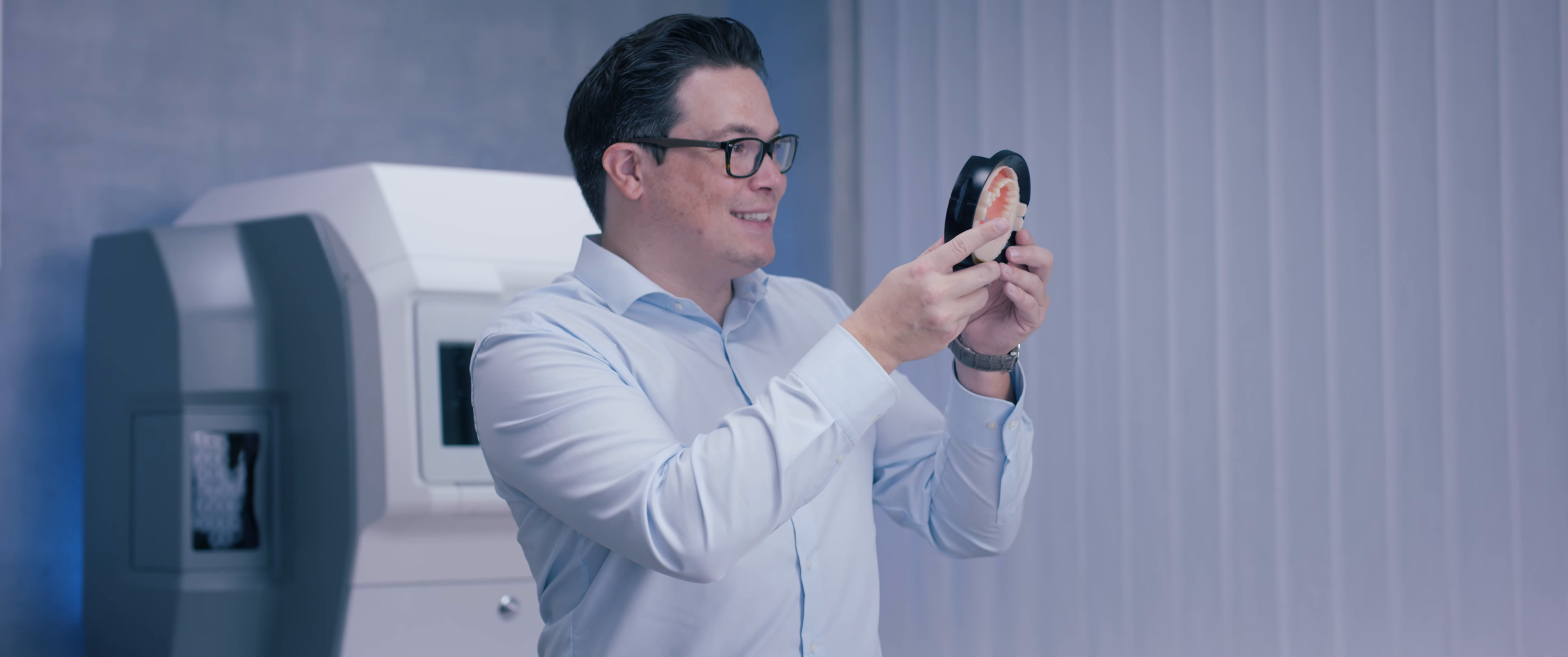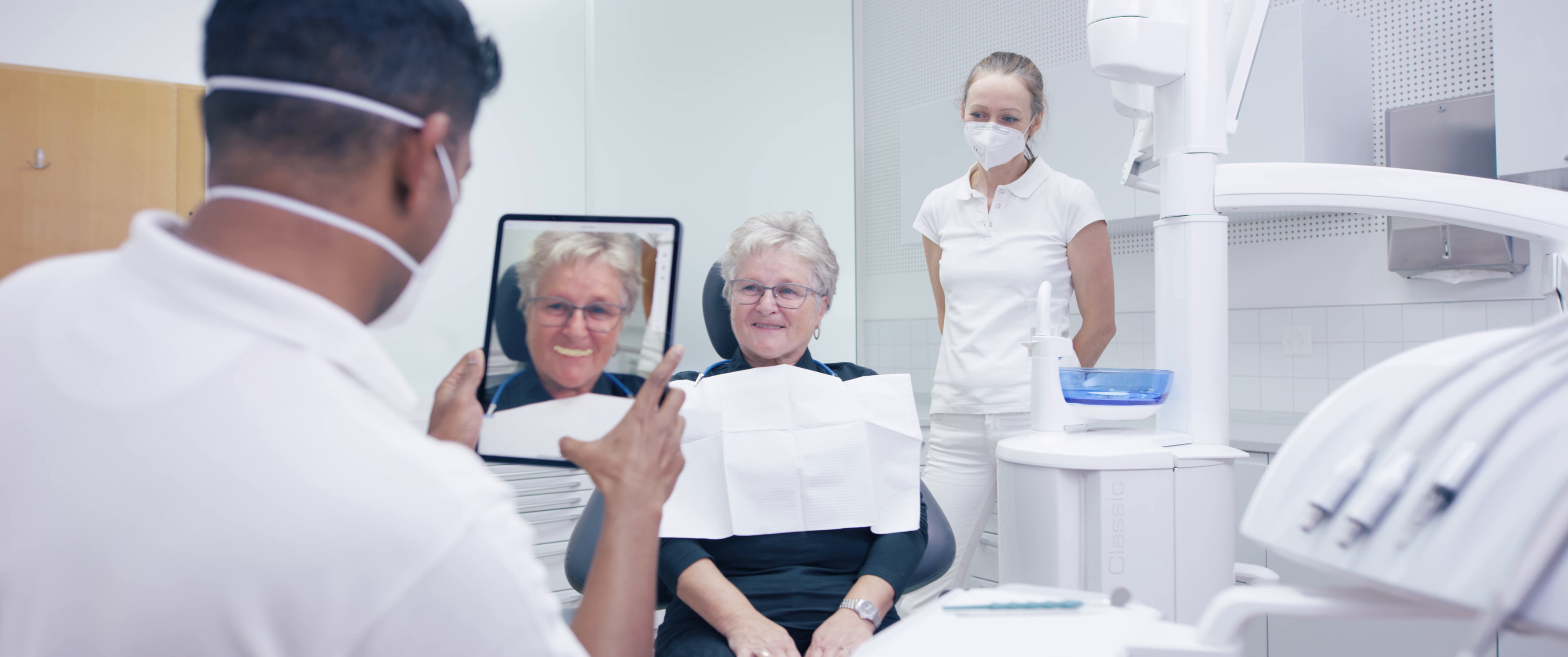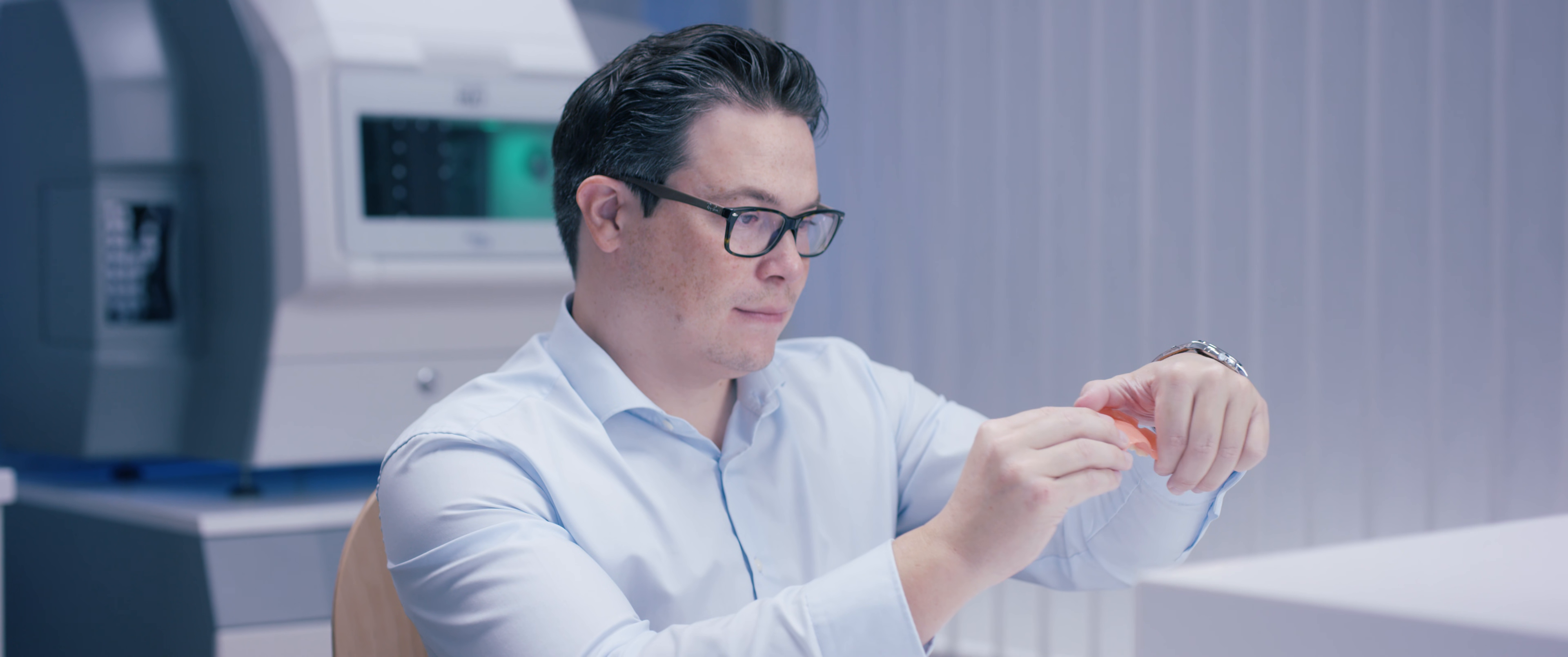If you're interested in finding out more about this fast, highly automated process with premium materials and predictable results for dental technicians, dentists, and patients, please visit our product pages for more detailed information.